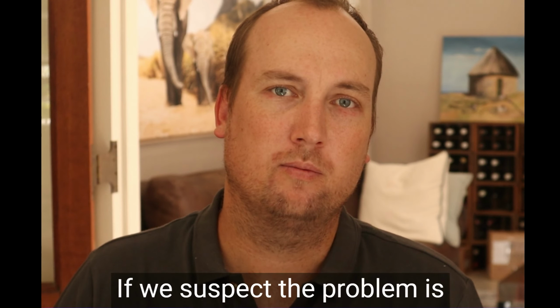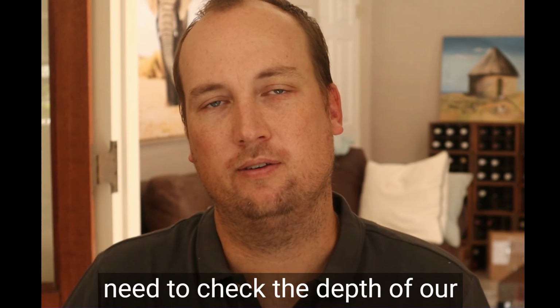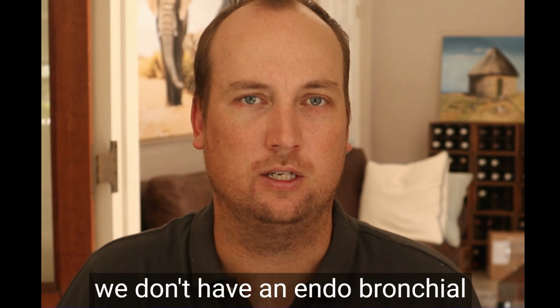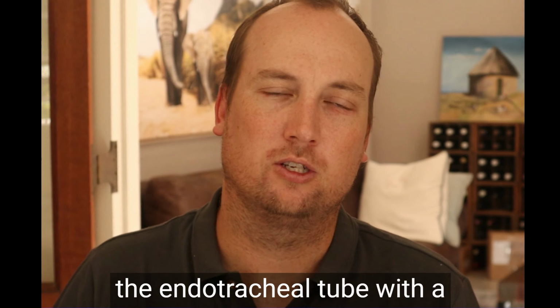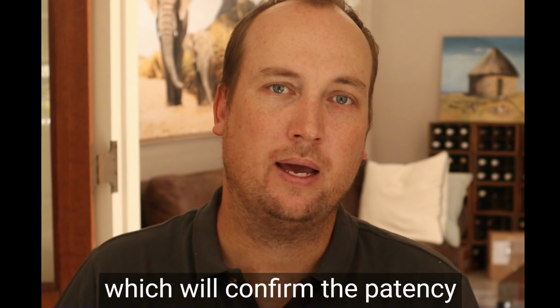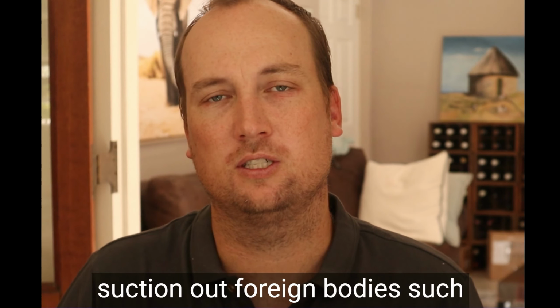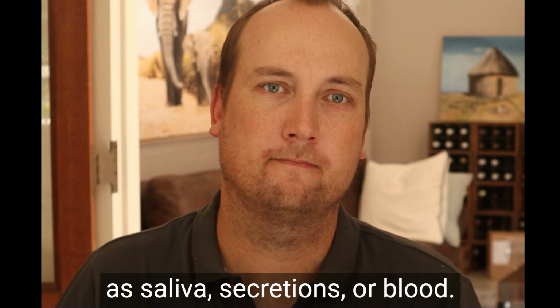If we suspect the problem is with our airway device, then we need to check the depth of our endotracheal tube to ensure that we don't have an endobronchial intubation. We can suction down the endotracheal tube with a soft, flexible suction catheter, which will confirm the patency of the tube and confirm that there are no kinks, but it will also suction out foreign bodies such as saliva, secretions, or blood.